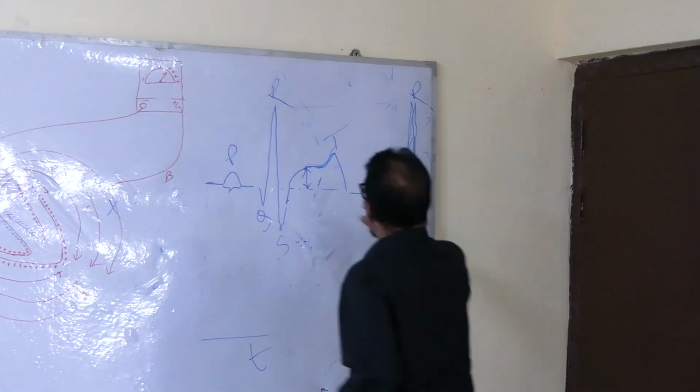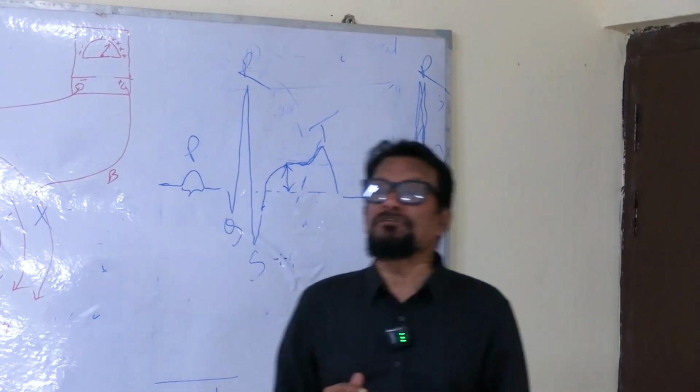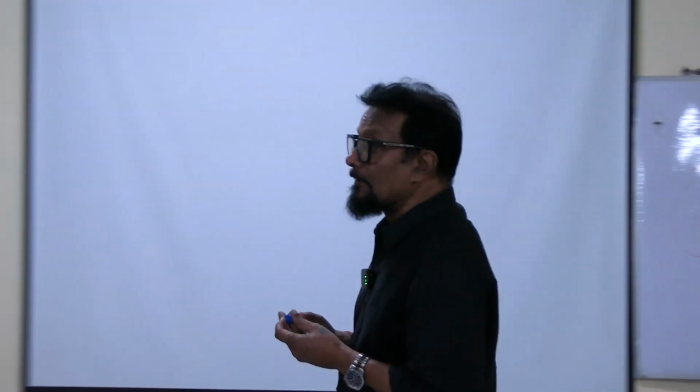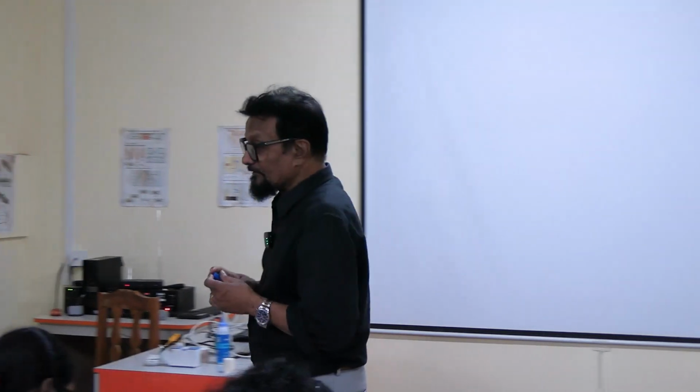Not only this, the T wave will also be changed. It may be biphasic, it may be small. The nature of the T wave also may change. We'll discuss this when we discuss myocardial infarction and the ECG changes. So these are the very important segments. First we will go into this.